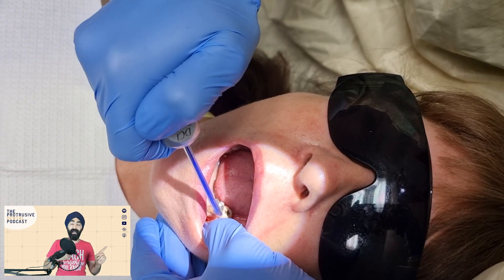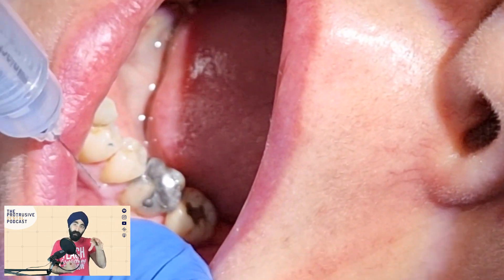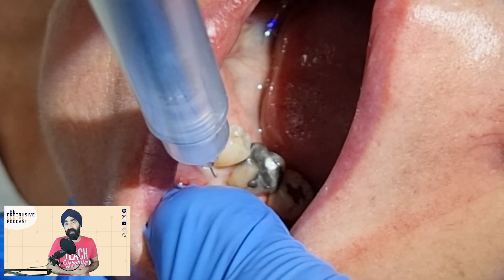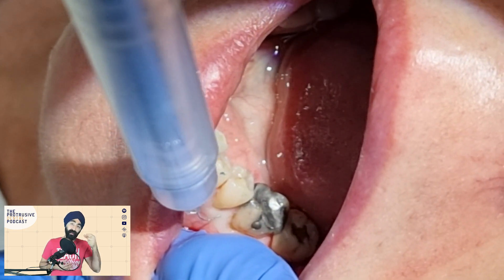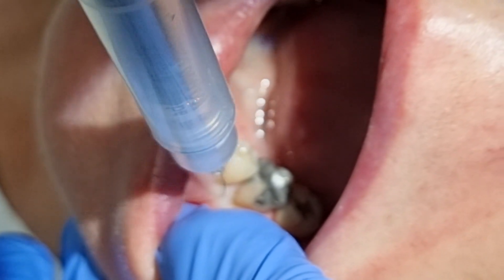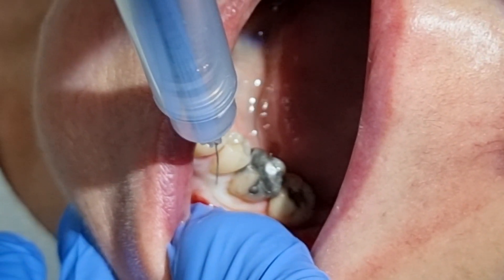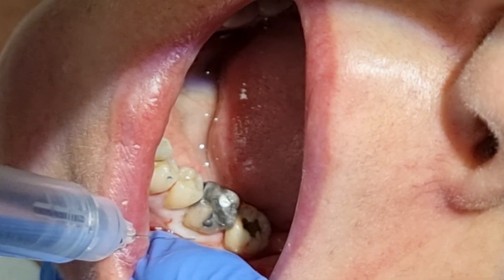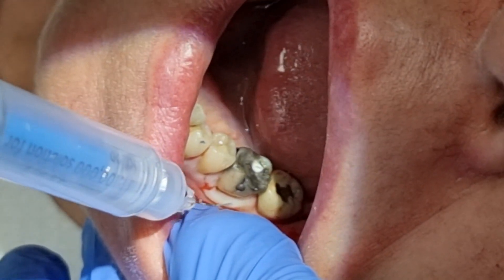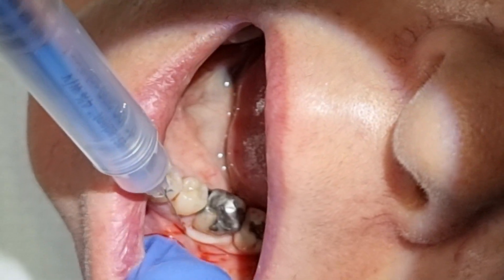This is the most important bit right here. To get sufficient anesthesia, it's all about the attached gingiva — you want to see the attached gingiva blanch, meaning it goes white. Then you want to put some mesial and distal, and if you have some leftover, put some buccal as well. If you don't have sufficient attached gingiva around the tooth, this technique is something I wouldn't use — I would give an inferior alveolar nerve block instead. But if I've got sufficient or normal amounts of attached gingiva, I get good success rates with this technique. That is really the secret right there. We see the blanching, and now distal — around about mid-distal. I'm going to deposit the rest inside there so you can see all the blanching all the way along. With any anaesthetic left over, I'm going to do a subperiosteal, just there — you can see that little sulcus area bubble up.